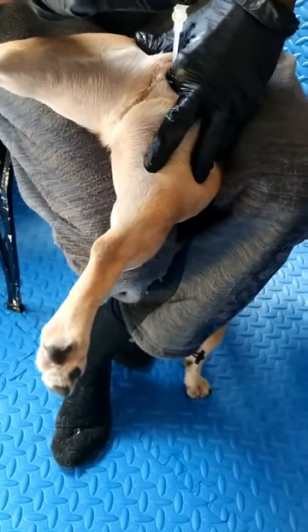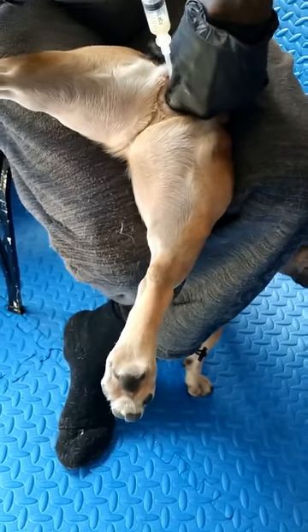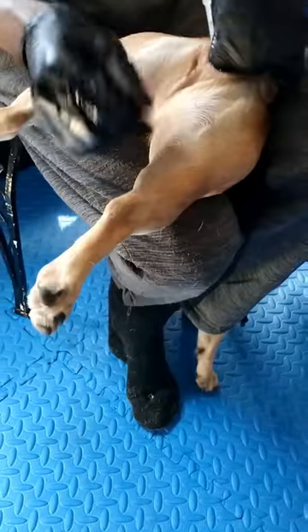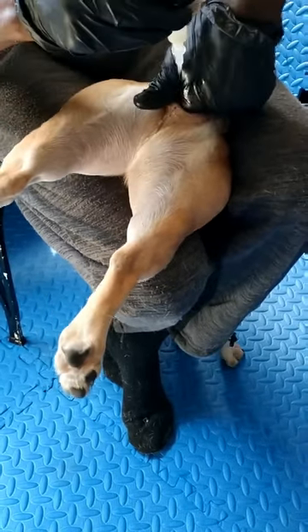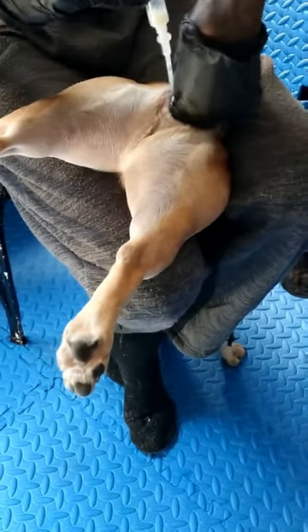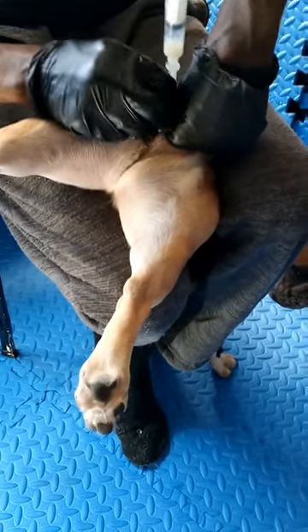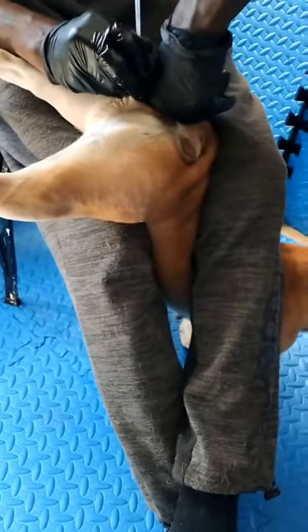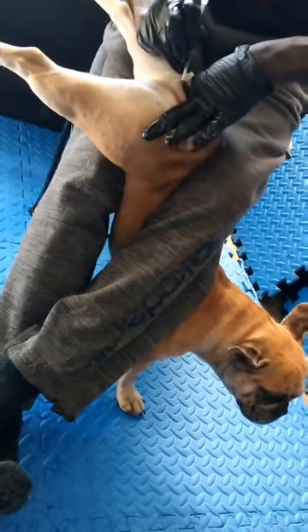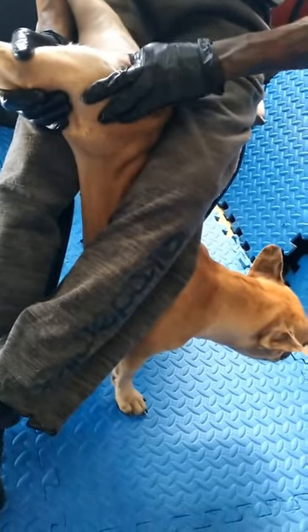This is position number two. A lot of females don't keep still for this, and if they break loose and run then the specimen will leak out. But after he gets all of the specimen in, she has to stay in this upright position for at least 20 minutes to half an hour. He's going to move his finger around just so she could clench, and that'll help with her pulling in the semen.